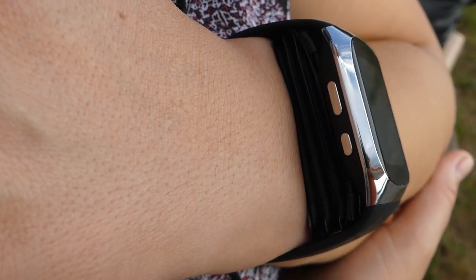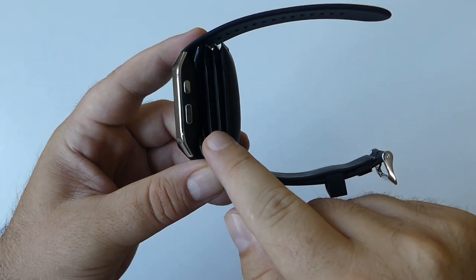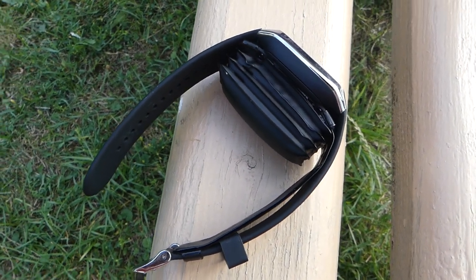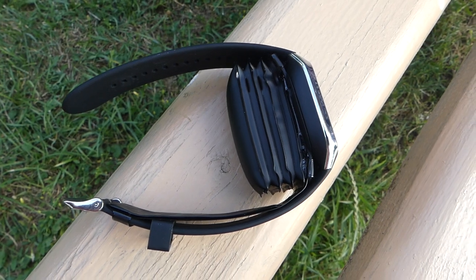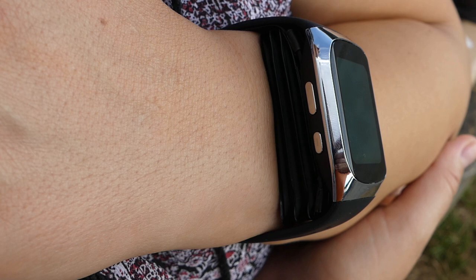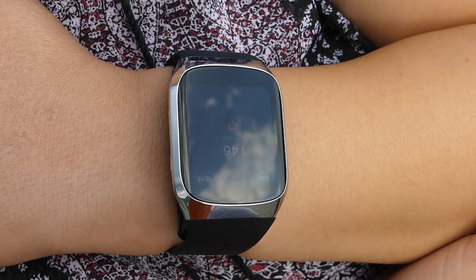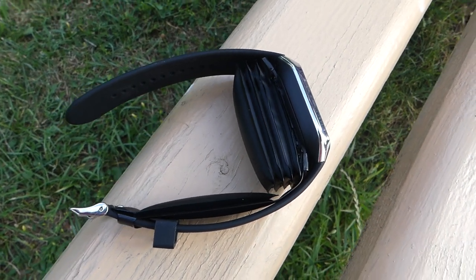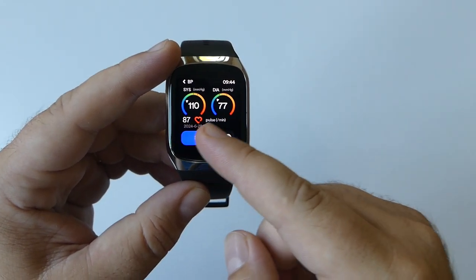The cuff features multiple layers that add structural integrity, ensuring it can withstand repeated inflation and deflation cycles without losing shape or functionality. The innermost layer is crafted for comfort and to securely hold the blood vessel in place, ensuring even pressure across the wrist during measurements. When activated, the cuff inflates to a predetermined pressure to compress the wrist and halt blood flow momentarily. As the cuff deflates, sensors measure arterial pulsation to determine blood pressure.